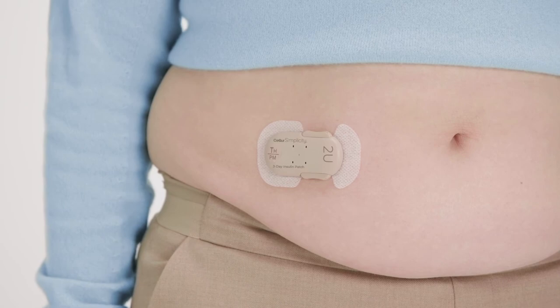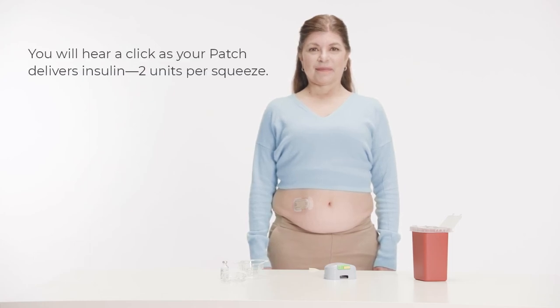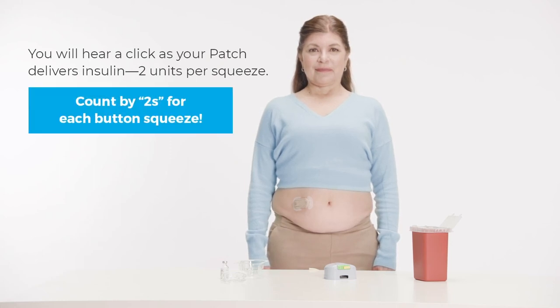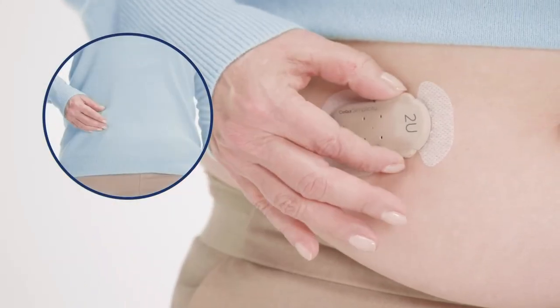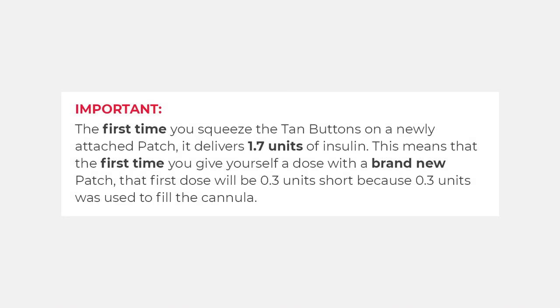The patch is prepared and ready to dose. When you need a bolus dose, squeeze the tan buttons — you will hear a click as your patch delivers 2 units per squeeze. Count by twos for each button squeeze; for 8 units, count 2, 4, 6, 8. The first time you squeeze the tan buttons on a newly attached patch, it delivers 1.7 units. This means the first dose with a brand new patch will be 0.3 units short, because 0.3 units was used to fill the cannula.